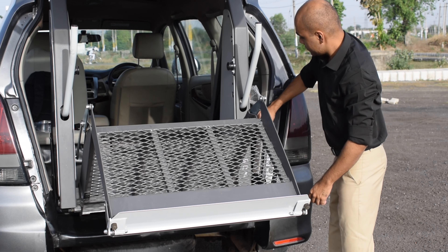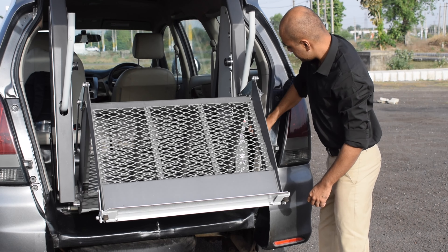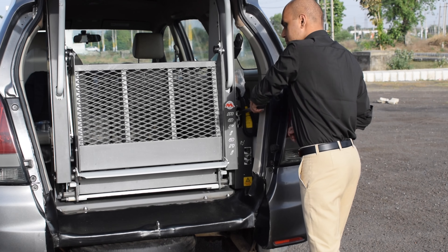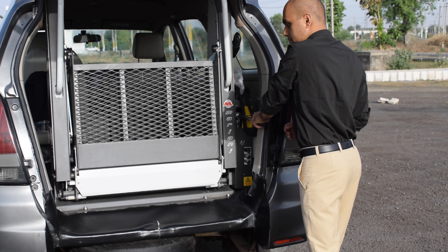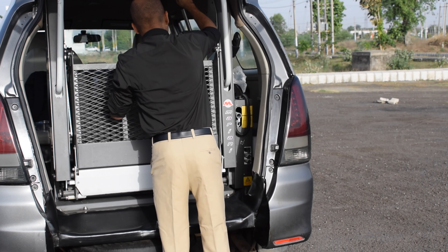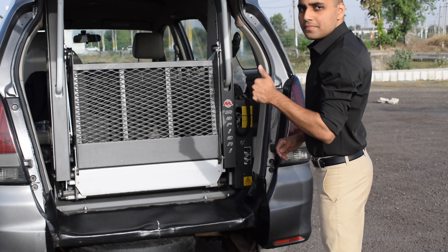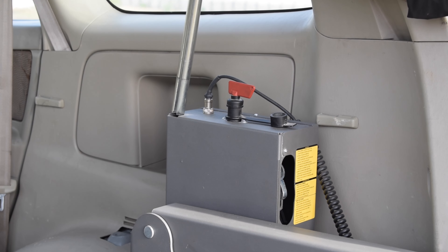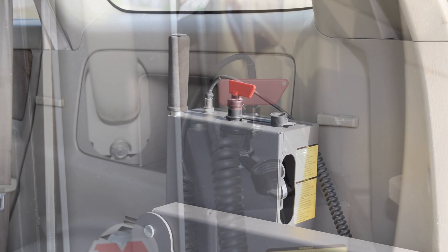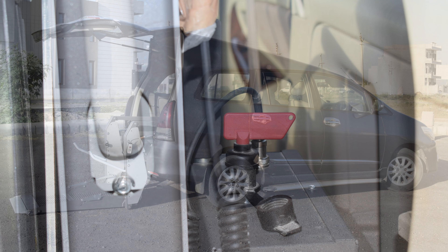The whole process might seem a little hectic and slow but it can save you if the battery of the car goes down. Last but not the least, always turn off the tap after the usage of the lift.